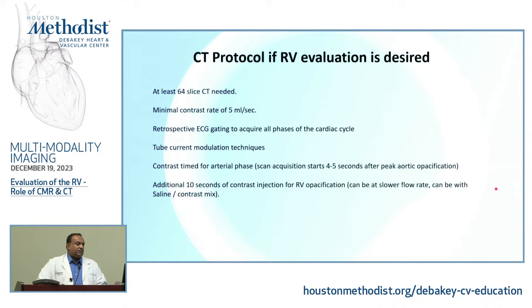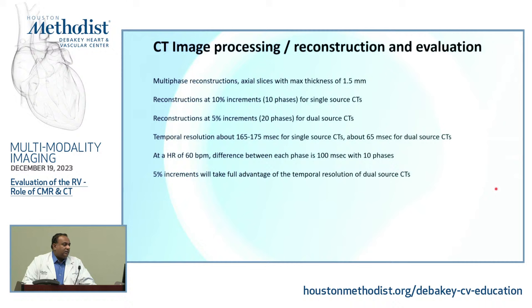The image processing and reconstruction is done with the help of whatever CT software you're using. For coronaries, remember, we look at very thin slices with the highest possible spatial resolution, 0.5 millimeter slices.